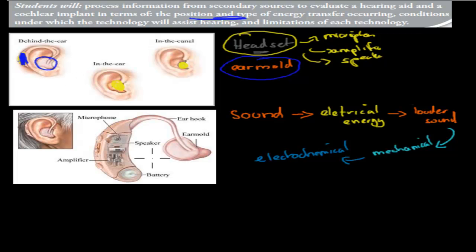And then remember, we've got these different parts. We've got the amplifier, the microphone, the speaker. We also have batteries, so this whole thing is battery charged, and that means you have to replace these batteries. Now, in terms of what kind of changes there are, well, sound comes, right?